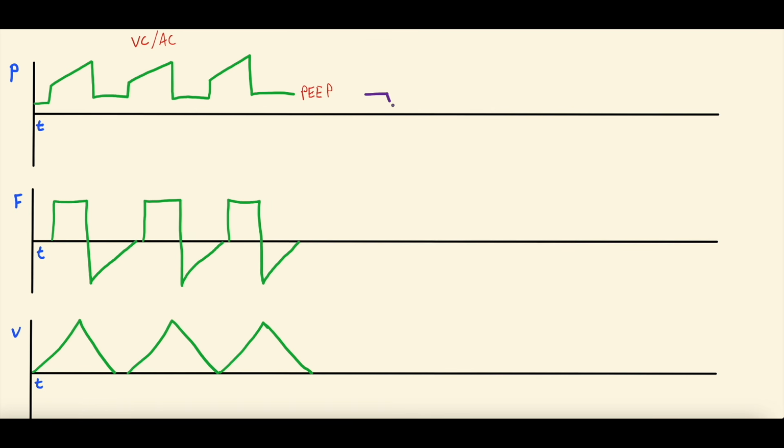They're sucking in, they're causing a negative intrathoracic pressure, so you often see the pressure dip just a little negative. Then they get their breath, and during this area where the pressure usually flattens out, what happens is they actually start to get this negative kind of dip, and then the pressure will go up again and come down.